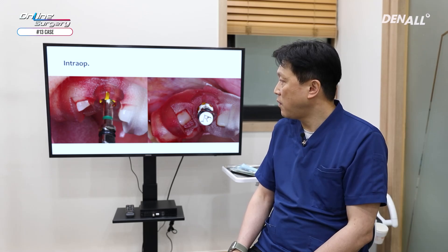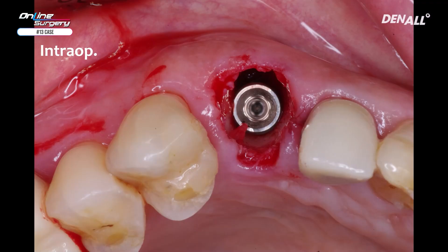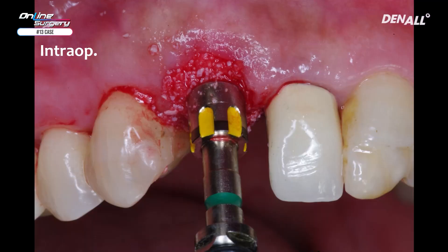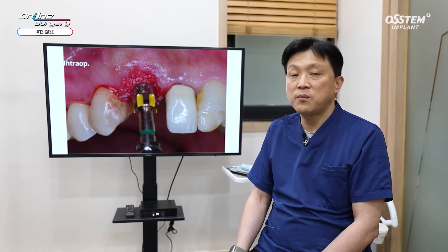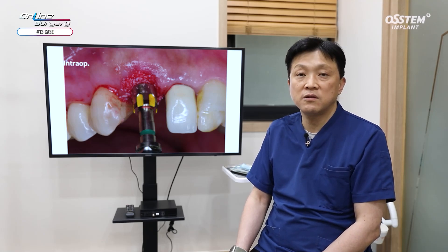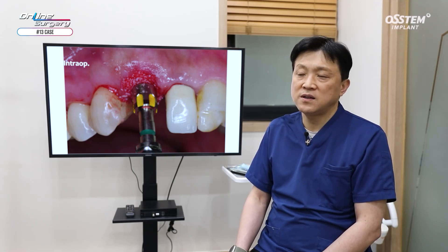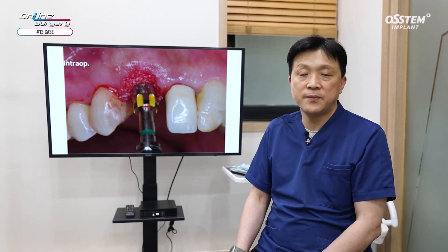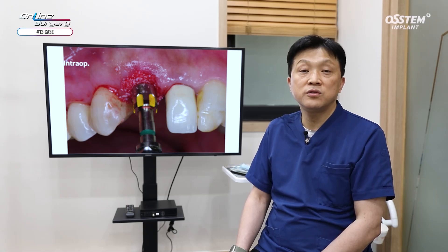Looking at the slot on both sides — buccal and occlusal view — the implant was placed accurately. There is significant buccal gap after implant placement. AOS collagen was used for bone graft. Based on the dual zone concept described by Salama, there is a bone zone and a tissue zone. Using bone graft material not only in the bone zone but also in the tissue zone helps prevent collapse of tissue. This is what is called the dual zone graft concept.